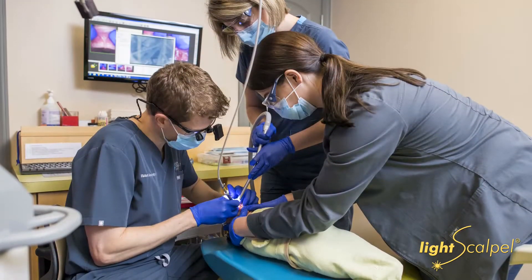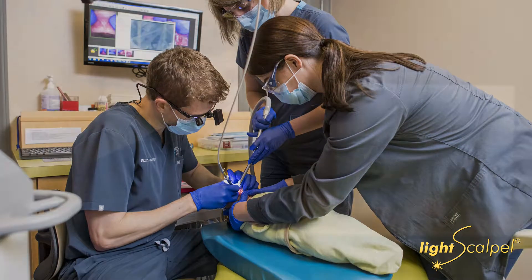My name is Richard Baxter, and I'm a board-certified pediatric dentist and diplomat of the American Board of Laser Surgery. We've used LightScalpel for about four years now. We've really enjoyed it — it's been such a helpful tool in our office.